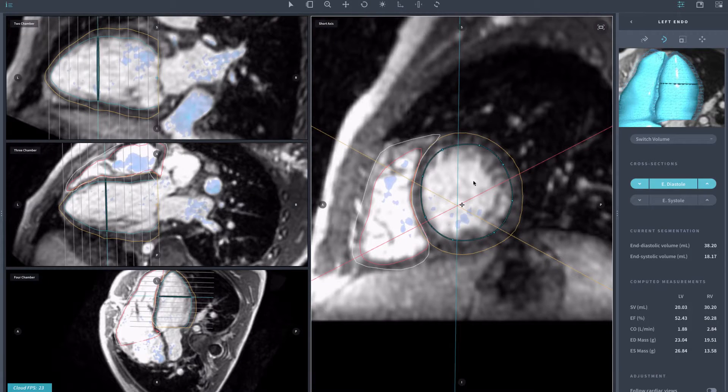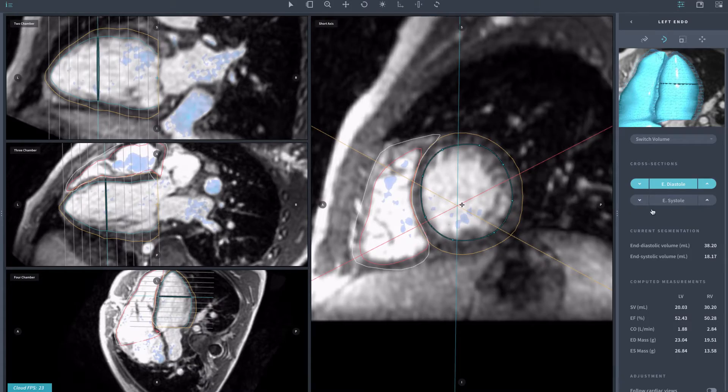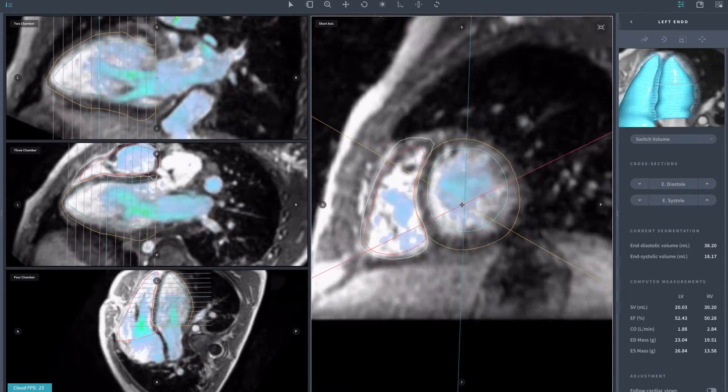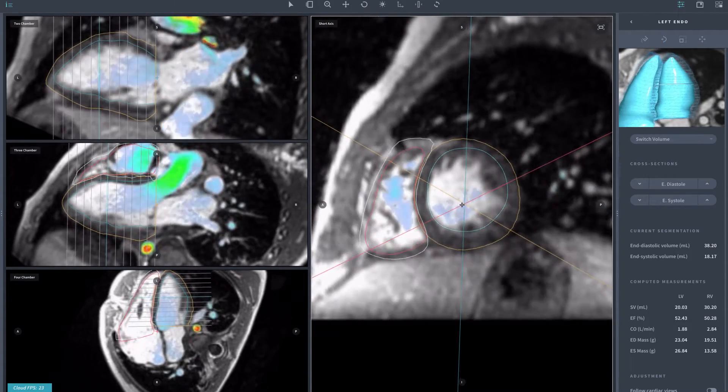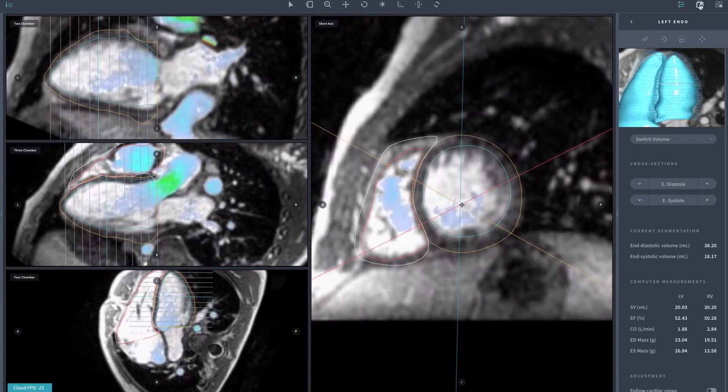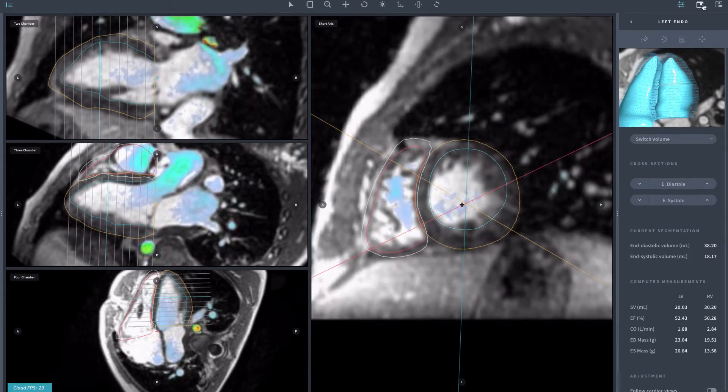4D-Flow is an imaging technique that lets us see blood flow and the function of the heart all in one exam. We're able to do quantitative measurements of the heart size, its function, both the left and the right side, and blood flow inside and outside of the heart.